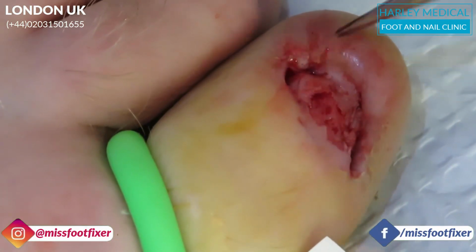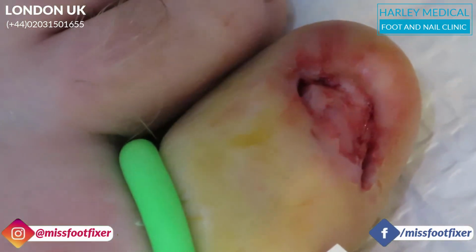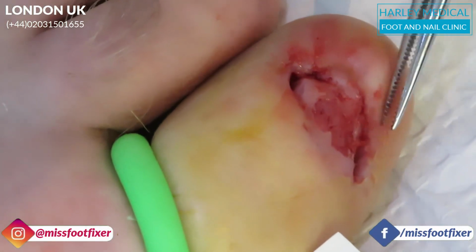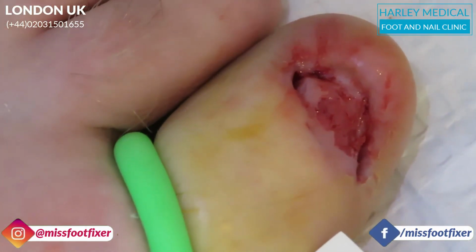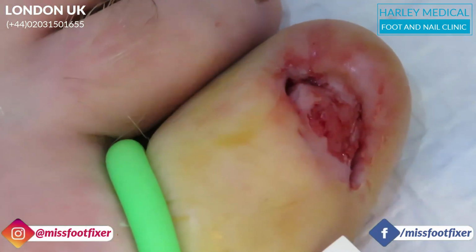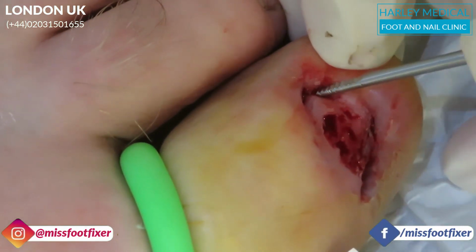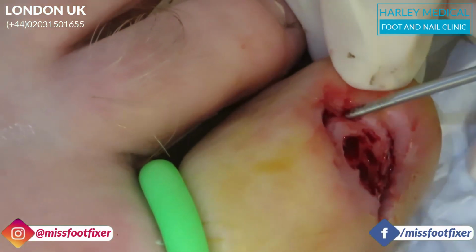Okay, it's been on for maybe less than 8 minutes. Okay, 15 blade, please. And then let me just check. Oh, 15, not 10. Well, I could use a 10. No, 15 blade's better. Let me just check this out. What is this clicking noise? Oh, just debris.